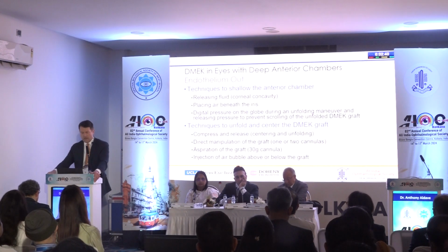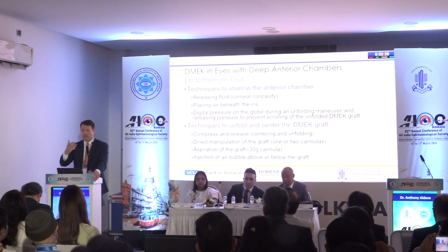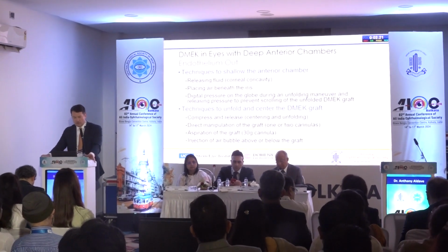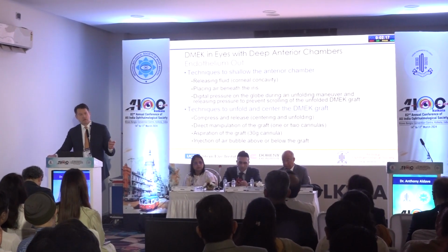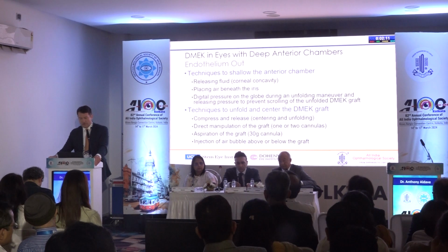So in cases of endothelium out techniques to shallow the anterior chamber, releasing fluid, we're all familiar with that, placing air beneath the iris. People say, well, don't you have to get that air out? Yes, you would ideally, when you're going to be taking the air out at the end of the case, push on the iris and try to burp it through. But a very small amount of air behind the iris is usually not an issue. Digital pressure on the globe during the unfolding maneuver, and then releasing it to prevent scrolling of the graft once it's unfolded.